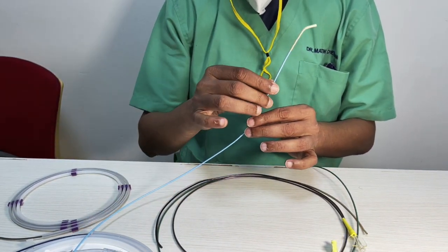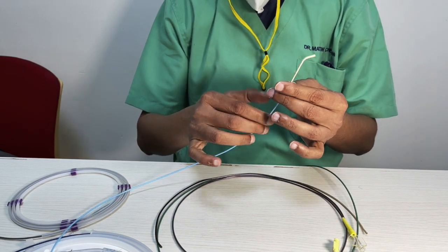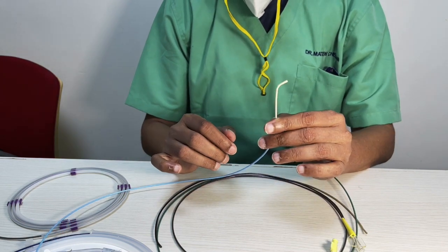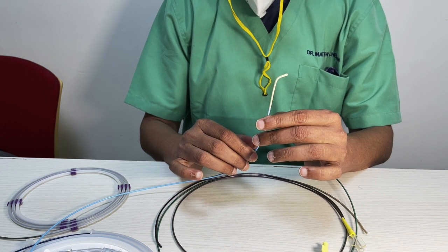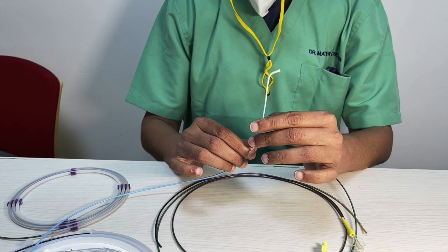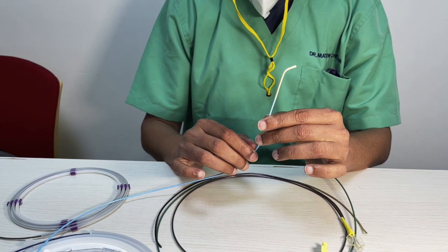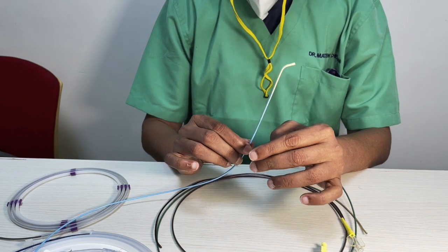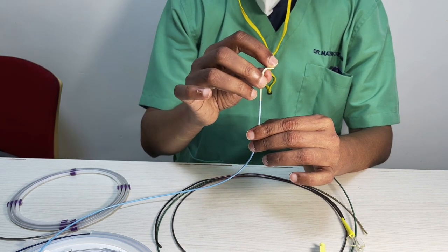So the limitation of this is, since we have got just two zones, and this also is not very soft, the maximum you can take this guiding catheter is to the level of the petrous segment of the internal carotid artery. Even that can become very challenging if we have got a bend or a tight tortuous loop, because this catheter would end up inducing severe spasm.